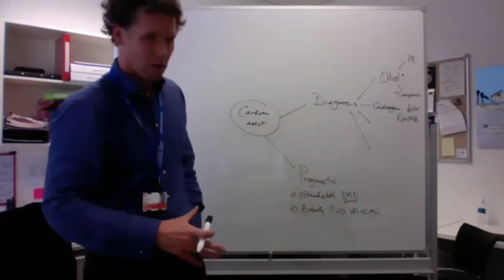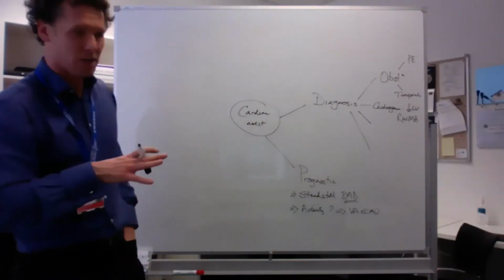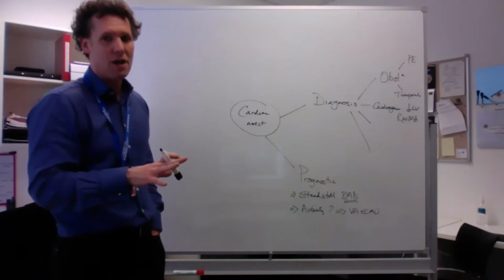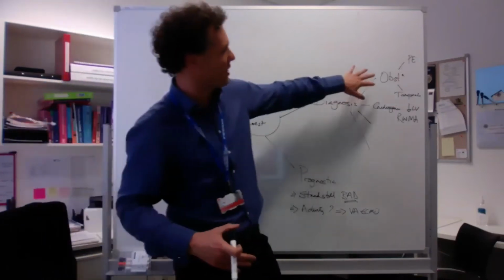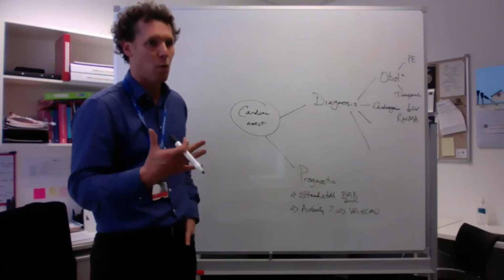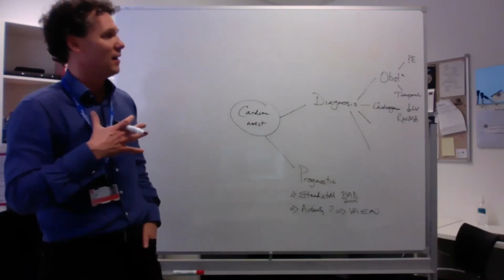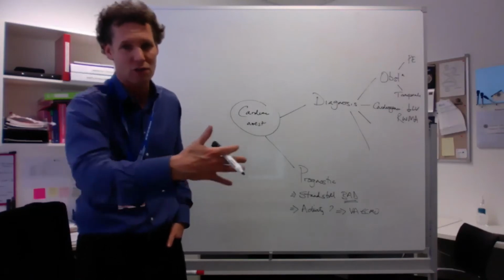All right, okay. Raymond, help us out. How can we develop this a little bit more? I'm not saying anything we got is wrong here. Help me fill in some of the gaps. Why don't we start with the diagnosis as well? What we are looking for on the echo is signs of reversibility. I think we've said obstruction, PE, and tamponade, and absolutely that's right. We'd have to add something about what you're looking for: big blown out right ventricles, an echo-free space with free wall collapse of the right atrium, left atrium, or right ventricle.